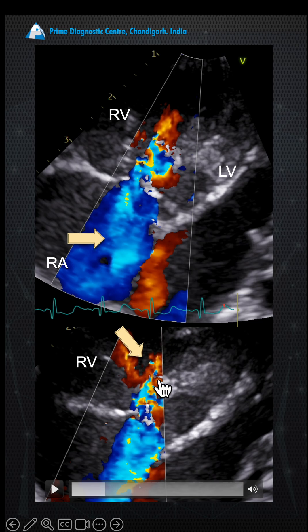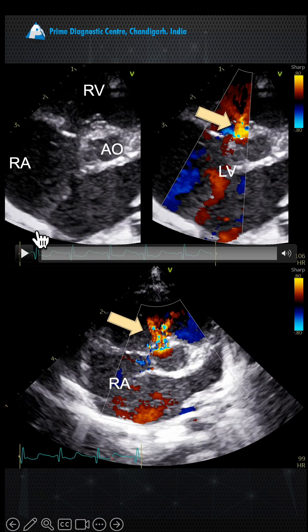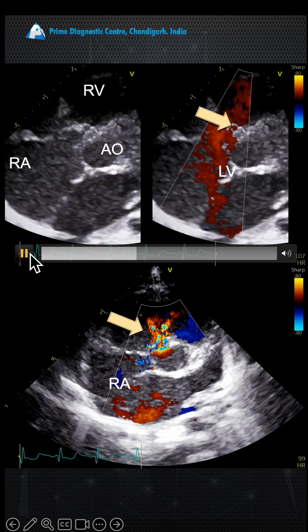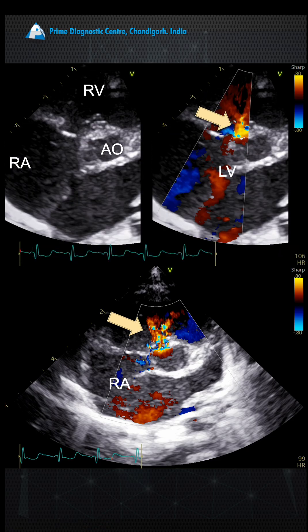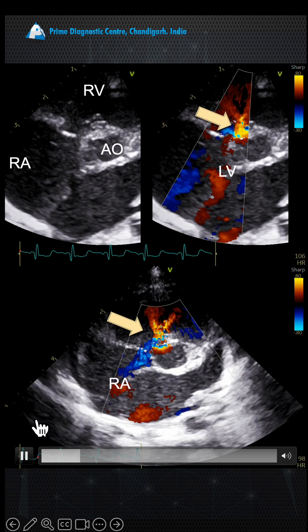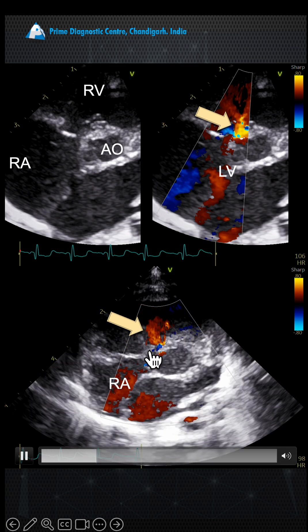This is the small VSD that you are seeing, and along with that you are getting a tricuspid — or LV-to-RA shunt — which I am going to explain in my subsequent slides. You can again see this jet going into the right atrium.